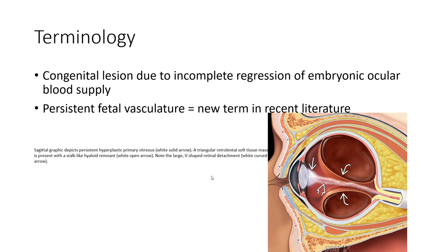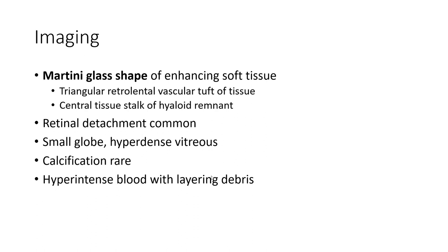On MRI, in cases of persistent hyperplastic primary vitreous, a triangular retrolental soft tissue mass is present with a stalk-like hyaloid remnant, indicated by the white open arrow, and a large V-shaped retinal detachment, indicated by the white closed arrow. Imaging features include enhancing soft tissue, a triangular retrolental vascular tissue, a central hyaloid remnant stalk, retinal detachment, small globe, hyperdense vitreous, and hyperintense blood with fluid layering.